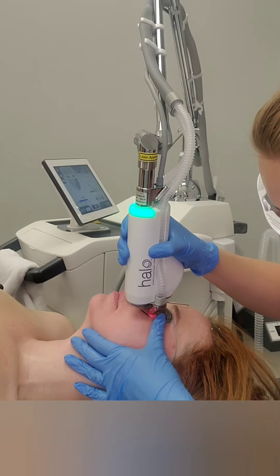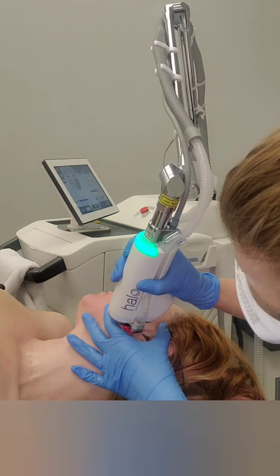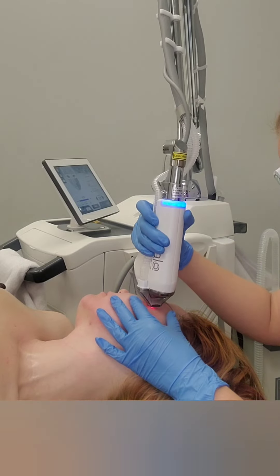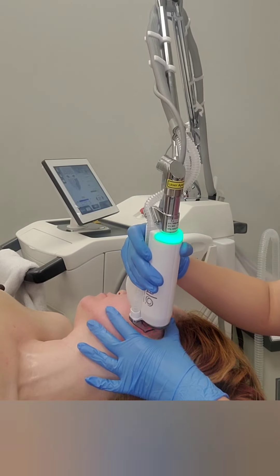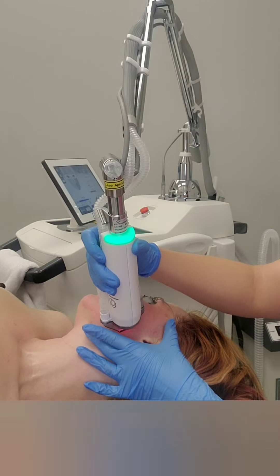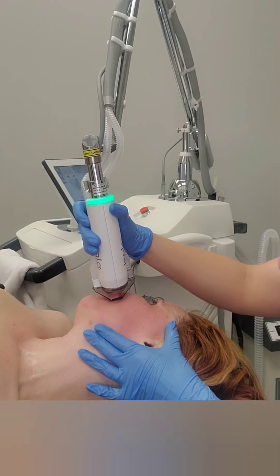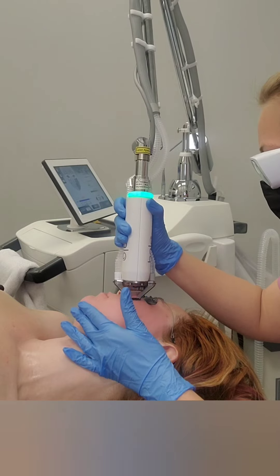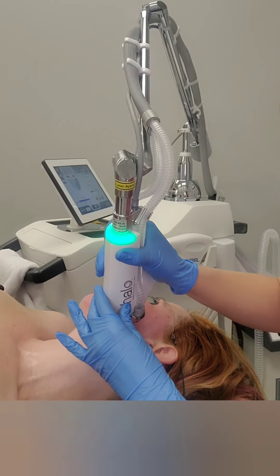As you can see, the patient in this video is very comfortable with very minimal discomfort, even going down to her neck and chest area. In between, when I am not firing the laser, I take the Avene Thermal Spring Water and spritz their skin where I'm not treating — that cools them back down, because you no longer have the Zimmer Chiller on their face. Just be careful where you spray the water: you don't want water to hit the area you're treating, because this laser is designed to pick up water and it will work on the surface level rather than targeting water deeper in the dermis.